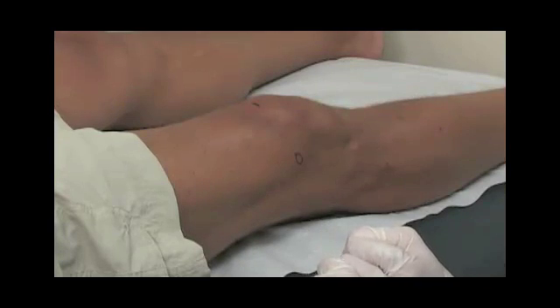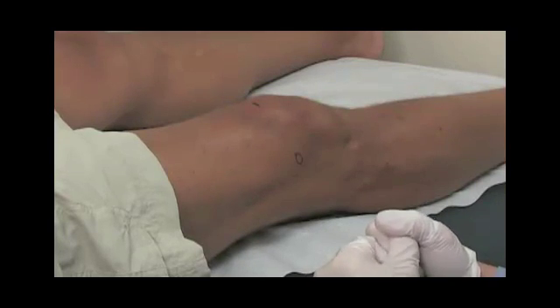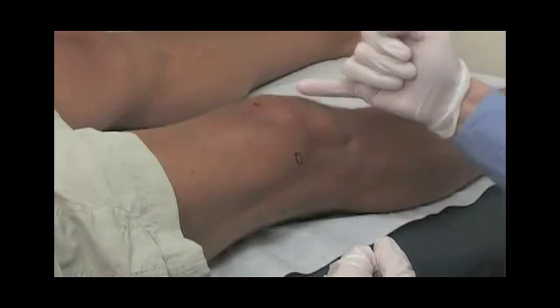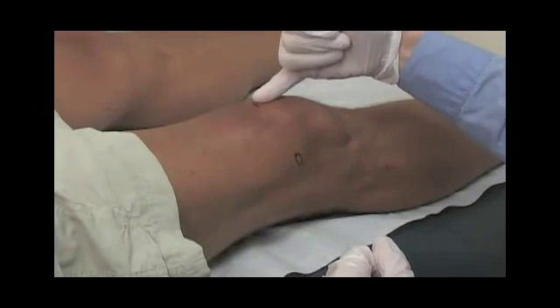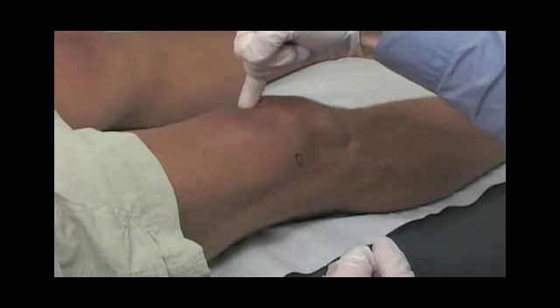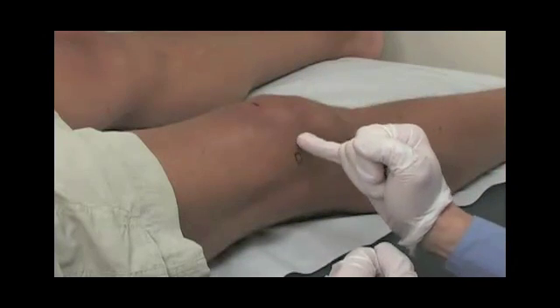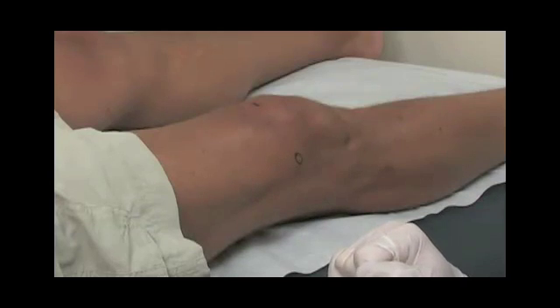This region is my injection of choice because we've avoided cartilage located throughout the knee joint, and really the bulk of the cartilage on the patella. Ultimately with this injection, our goal should be to avoid any more damage to the knee and any potential damage to the cartilage.